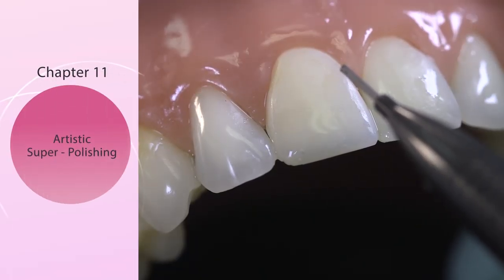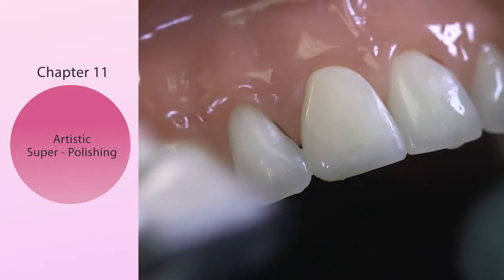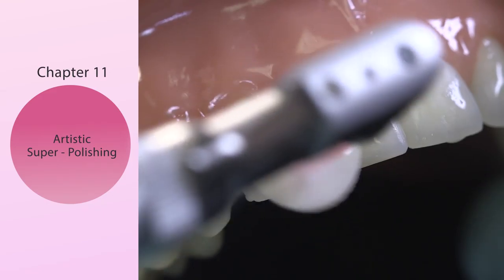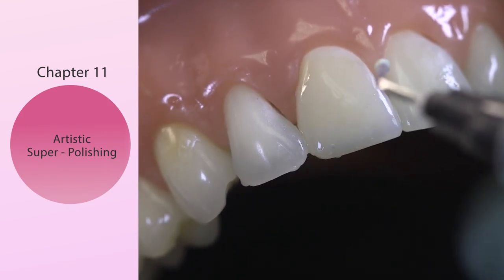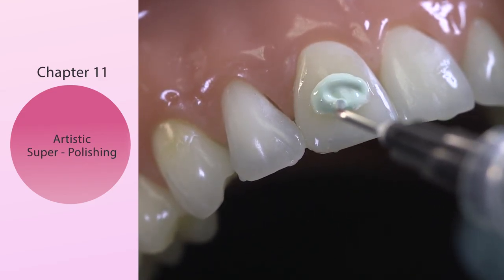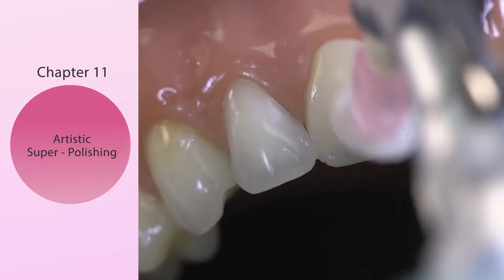For the final step, I'll demonstrate using a super buff and a mini buff disc with submicron ultrafine diamond polishing paste. For the final polish, we're going to take the super snap buff disc with a generous amount of water and put it on the tooth, making sure we liquefy the surface. Then I'll take the Direct Dia Paste — this is very fine, ultrafine, submicron diamond polishing paste — and put the polishing medium on the body of the tooth. We've removed the diamond polishing paste with the buff disc, and now I'm going to go back with the mini buff disc for the final hand luster and fine polish.